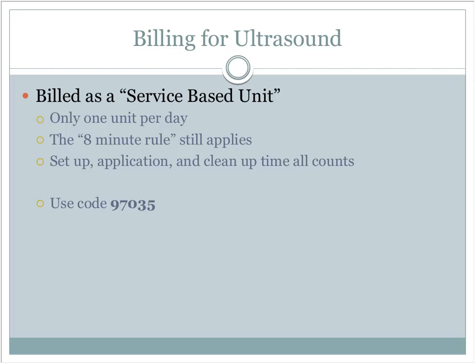Okay, so you can't do ultrasound for 3 minutes and be able to bill a unit. But that being said, again, if you're doing ultrasound for 3 minutes, we need to talk because that's still not okay. But within this, it does include the setup time, the application time, because you have to be providing this intervention. This is a hands-on intervention, and the cleanup time. That doesn't include the time it takes to launder the towels you used or transport the patient to and from their room. But getting it set up, applying the gel, turning the machine on, doing the treatment, wiping the gel off, checking the skin, all of that stuff counts.